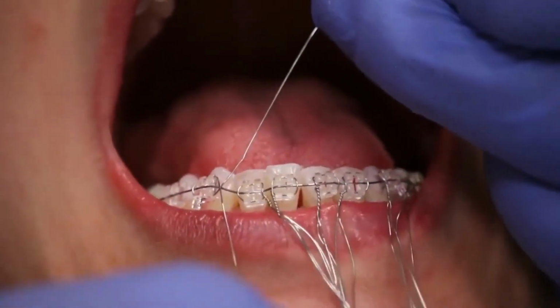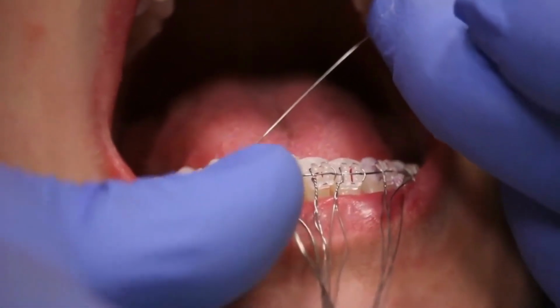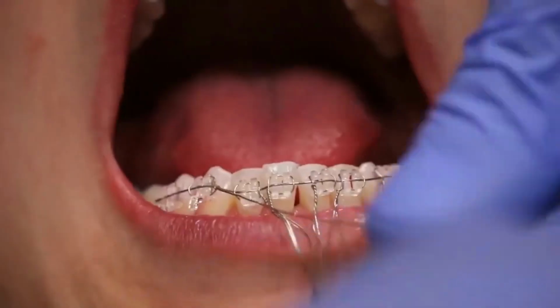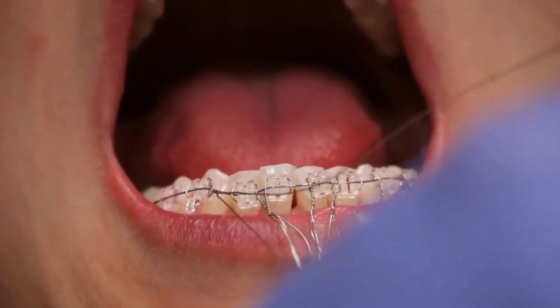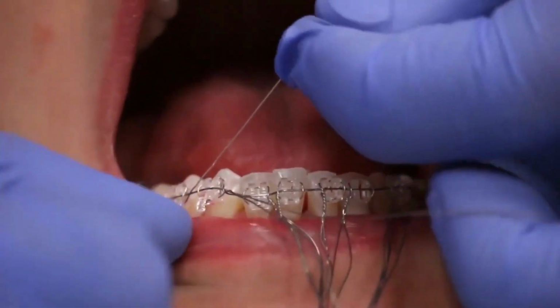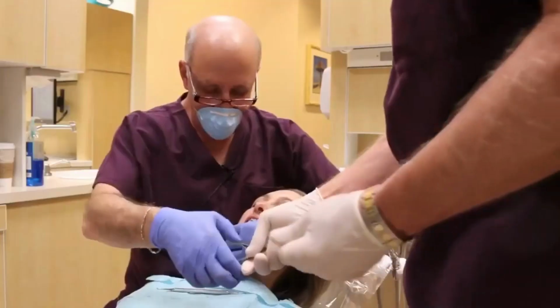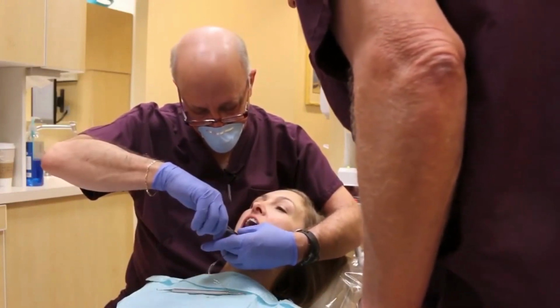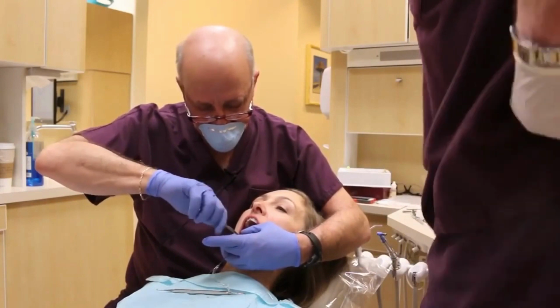Now you've seen me after every tie grabbing the plier. Sometimes if you want to tie faster, you can just secure the tie with a couple of twists and then get the next tie, have it ready, and secure the next one and go along that way and then tie each individual tie. That is another way to do it. It is up to you. I prefer the method of fully tying a tooth at a time.